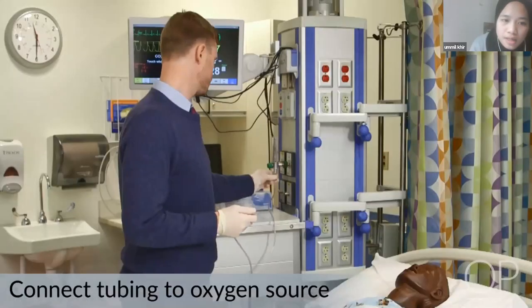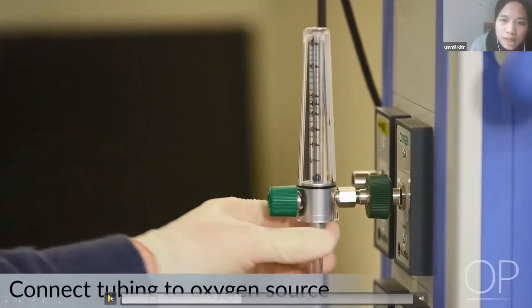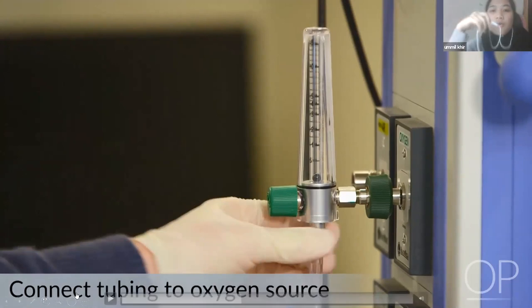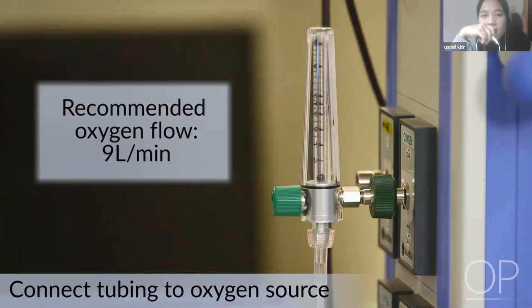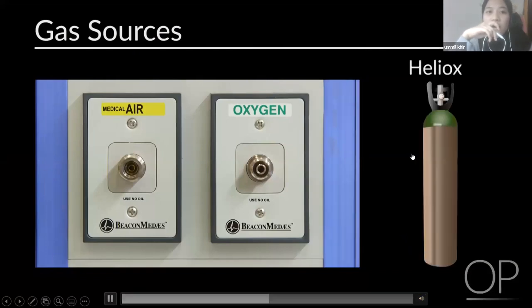And then connect the tubing to the oxygen source. So the recommended one. Next, the recommended oxygen source is... This is the recommended oxygen flow, 9 liters per minute. So these are the gas sources.